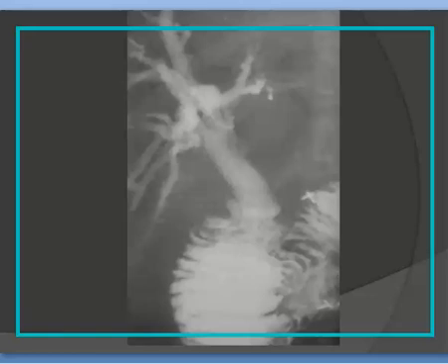Here is the biliary tract, and this is the common bile duct, and the region of the gallbladder is not well opacified. Then the distal end of the common bile duct is directly going to fill that part of the duodenum. Sphincterotomy, to be continuous with that part of the duodenum which is markedly full. Sphincterotomy can result in such appearance as reflux can go up.